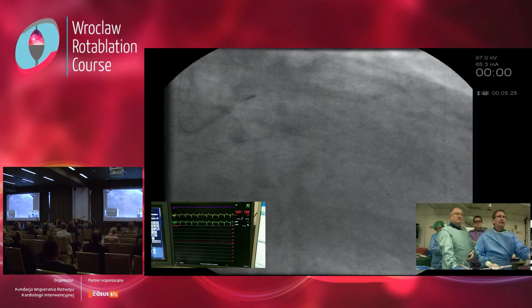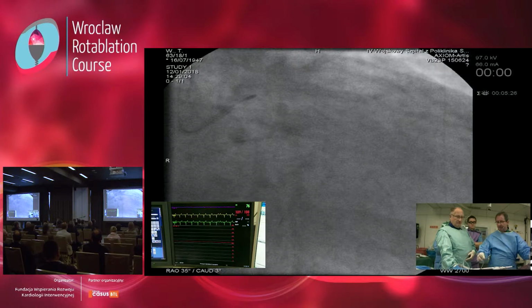Now you're switching to high speed? Yes, the first step was on dyna just to relax the system, and now I'm going to the high speed.